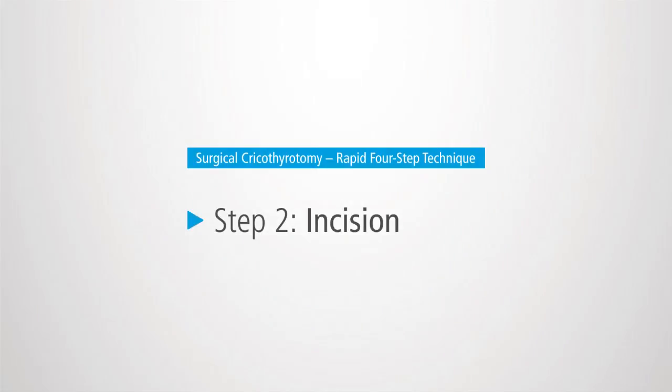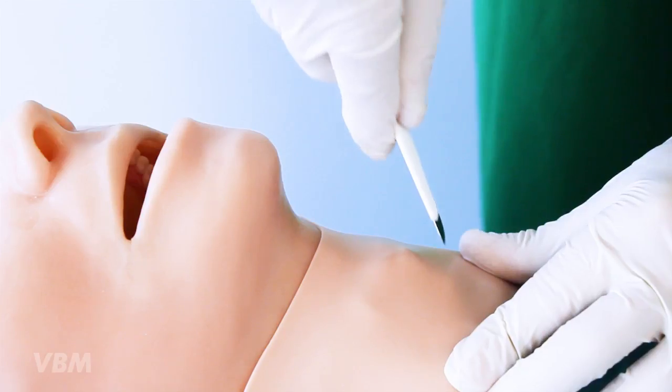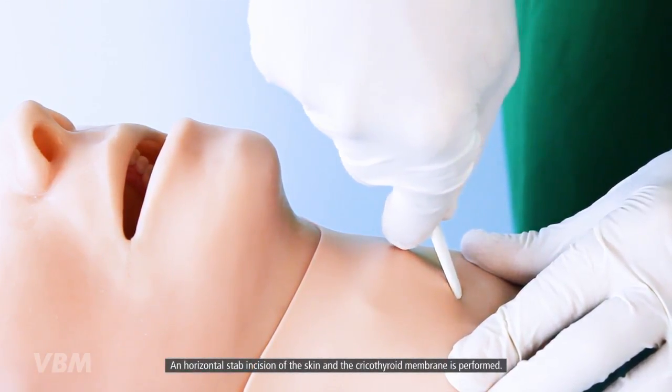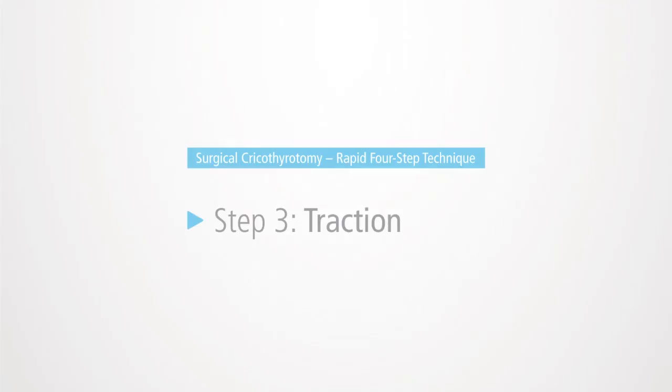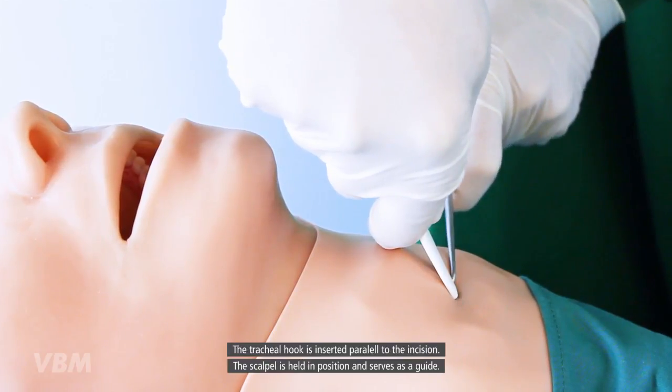The size 20 scalpel is held in the dominant hand and a horizontal stab incision of the skin and the cricothyroid membrane is performed. The tracheal hook is then inserted parallel to the incision while the scalpel is held in position and serves as a guide.